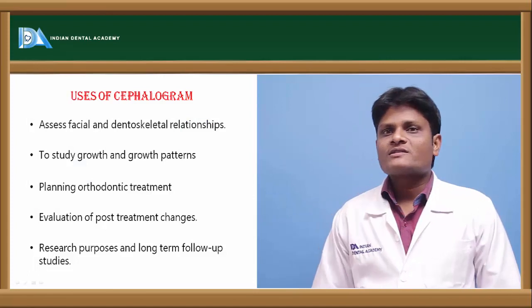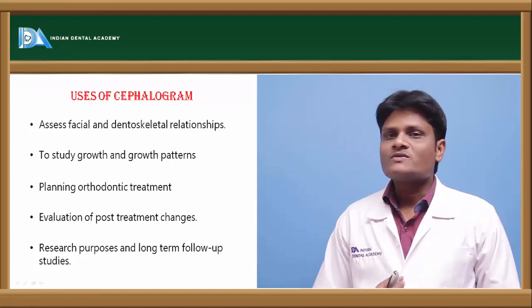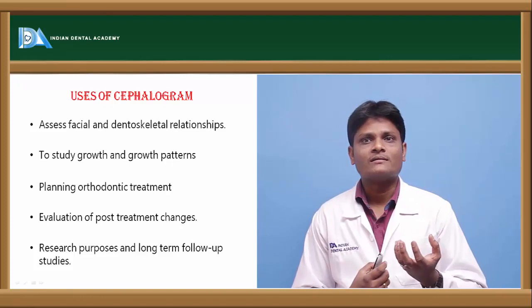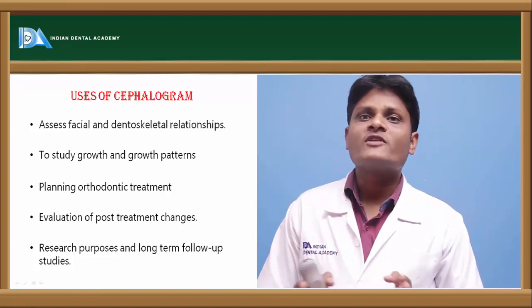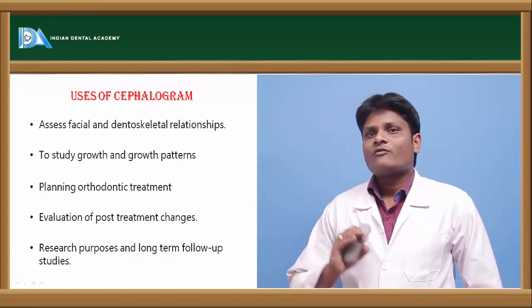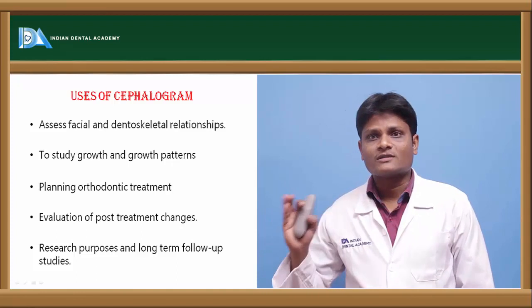Okay. Now let us look into the uses of lateral cephalograms. The lateral cephalograms are mainly used to assess different components of the craniofacial skeleton, whether the different components of the craniofacial skeleton are normally related or there is any deviation in the normal relationship. So assessment of facial and dentoskeletal relationships is one of the important uses of lateral cephalogram.